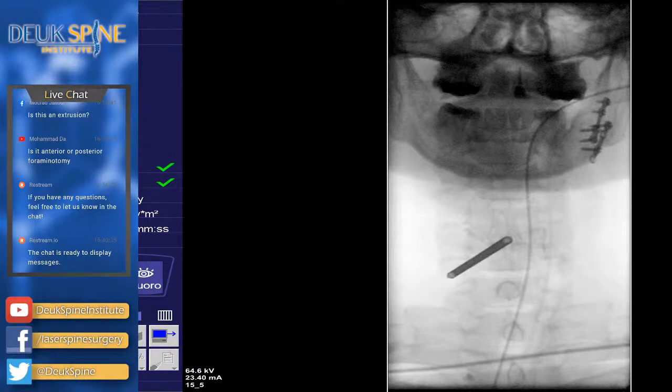So any questions from the audience at this point? Yes, we do have a question coming in from YouTube. One of our viewers is wondering, is this surgery done anterior or posterior, and is it different from a foraminotomy? Yeah, it's a great question. The surgery is done anterior. We're going through the front of the patient's neck.